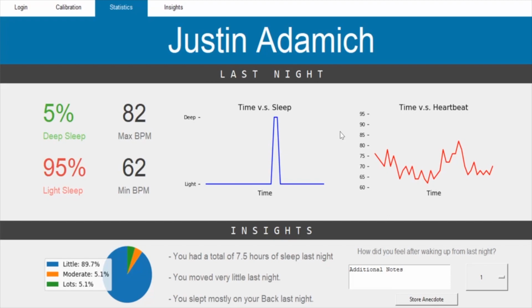So this page will go through the log file and present some interesting numbers and some facts about your sleep. It will tell you the percentage of time that you were in deep sleep or light sleep, which is also shown in this graph. It will calculate the min and max heart rate during the night and also show it here in this graph. Down here, these are some interesting facts about your sleep.